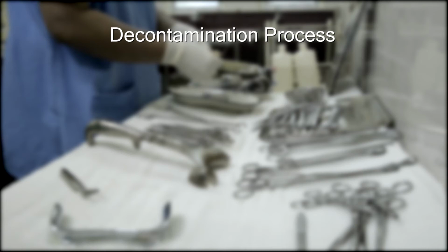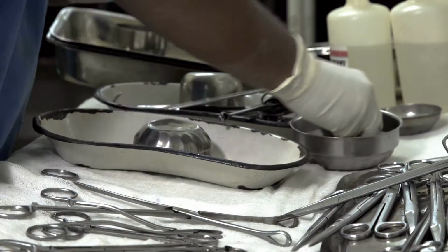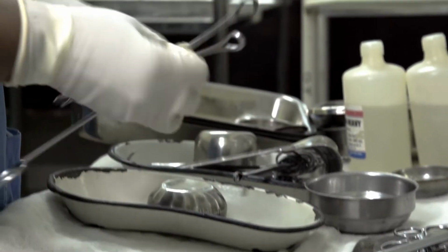The decontamination process includes 3 steps: disinfection, cleaning, and sterilization. Decontamination of all used items should be done in their respective units like labor rooms, operation theatre, etc.